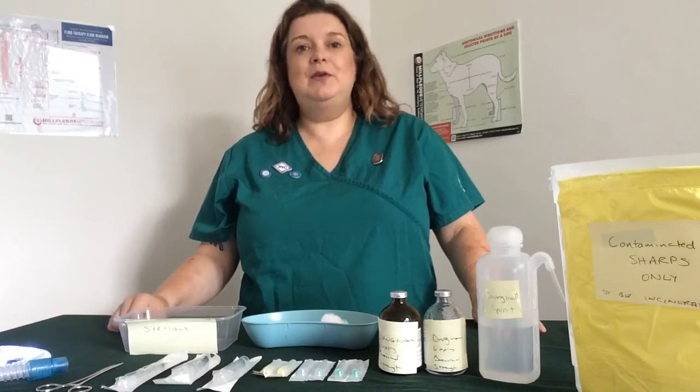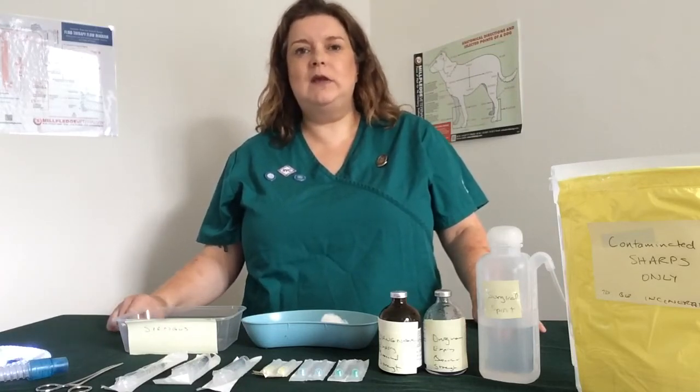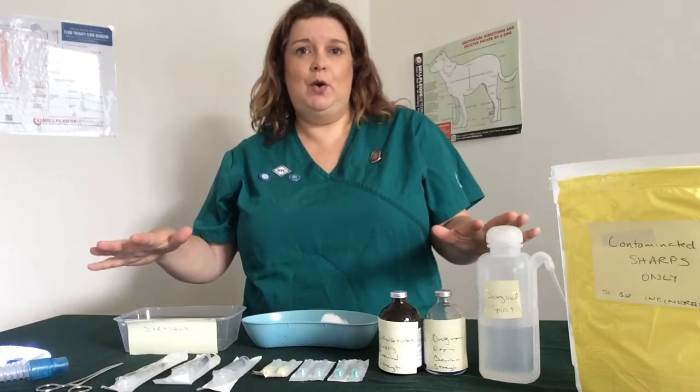This time you're going to be drawing up an injection. I'll do the calculations and administering in another video to keep them nice and short, because there's quite a lot in this one and the steps aren't always that much of a guide. So you've got all your equipment here ready to go.